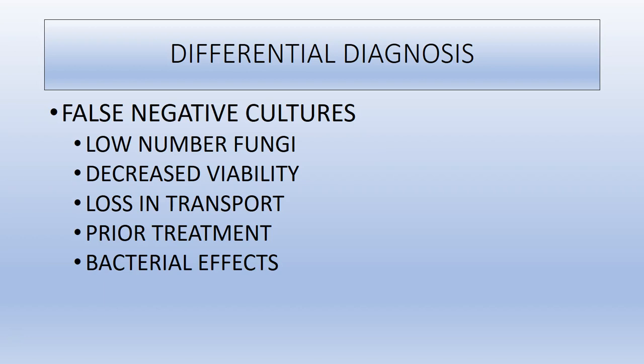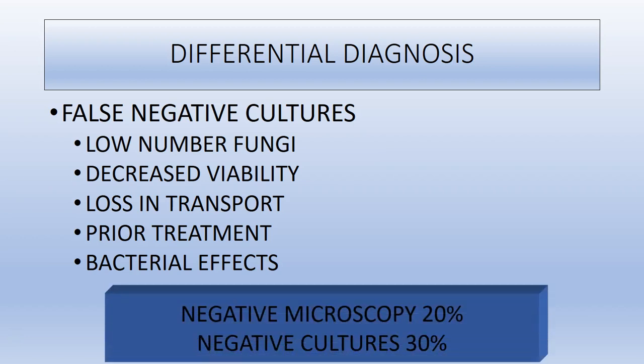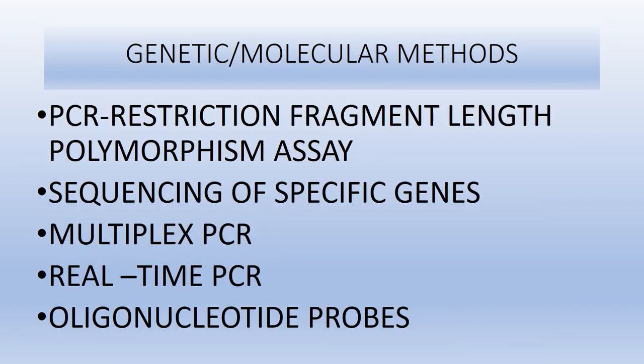Frequently, there's a low number of fungi. They may have decreased viability, and we lose them in transport. If you've been applying topicals or using orals, or the patient's had some prior therapy, this will affect in some patients the culture results, and we have the effects of bacteria. So unfortunately, false negative cultures are quite common.